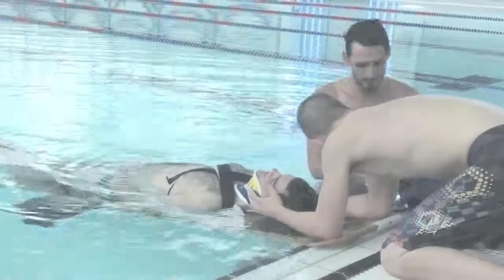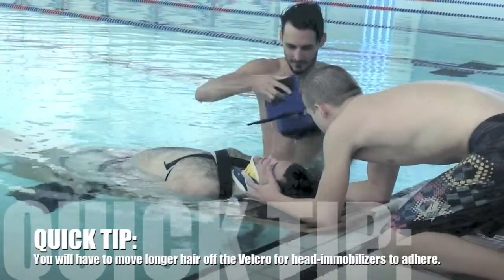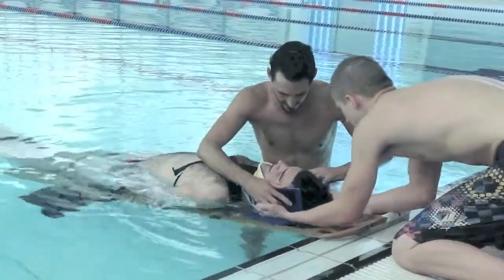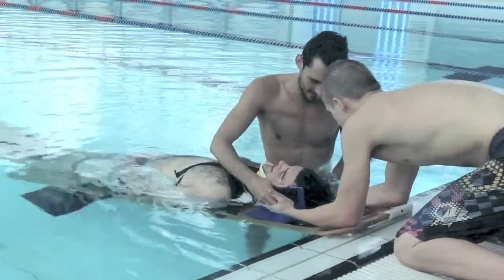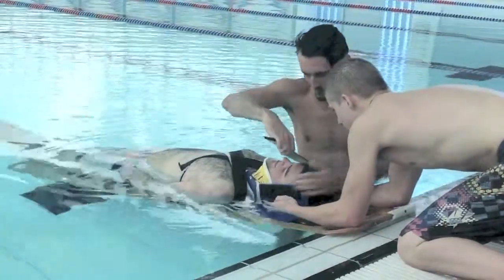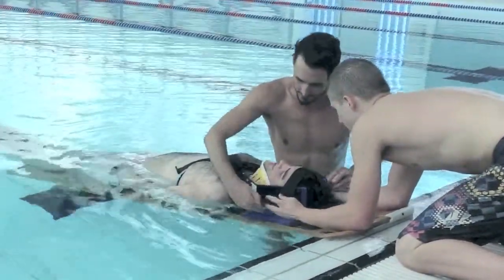Step 8. Securing the head immobilizers. The primary responder should place both head immobilizers at the same time. On their count of 3, the secondary responder will flare their hands out of the way. Once the head immobilizers are in place, the secondary responder will reposition their hands until the forehead strap is secured across the victim's brow. In the deep end, the primary rescuer should secure the head immobilizers from the deck.